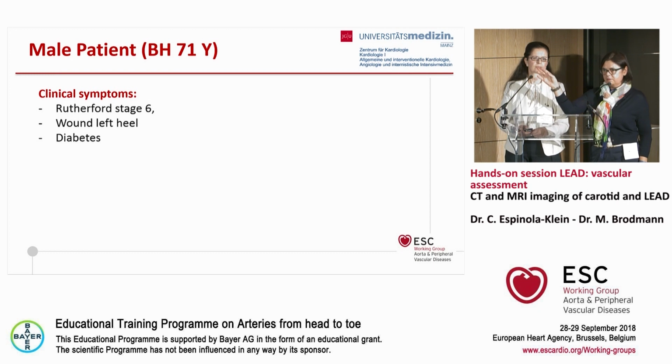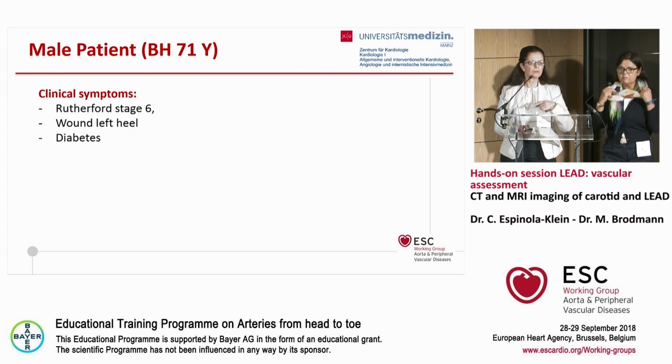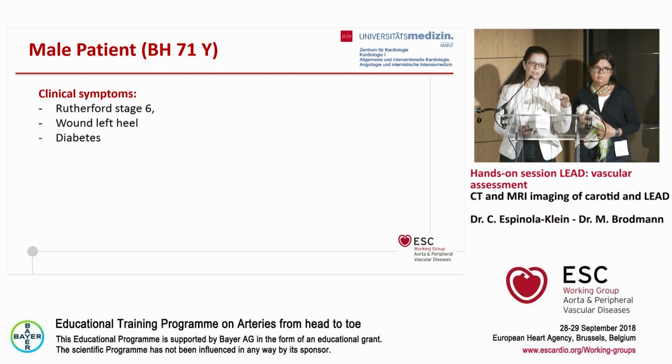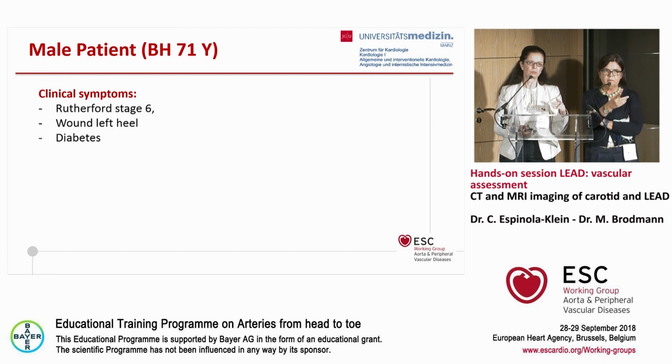And this is just for mapping, and the ultrasound is just for getting the... Christine has also pointed it out, it's also about hemodynamics. So we should not forget about that. All patients we perform MRI have previously the decision that we want to do something. Now, only in these cases we perform additional imaging. I completely agree with Marianne.